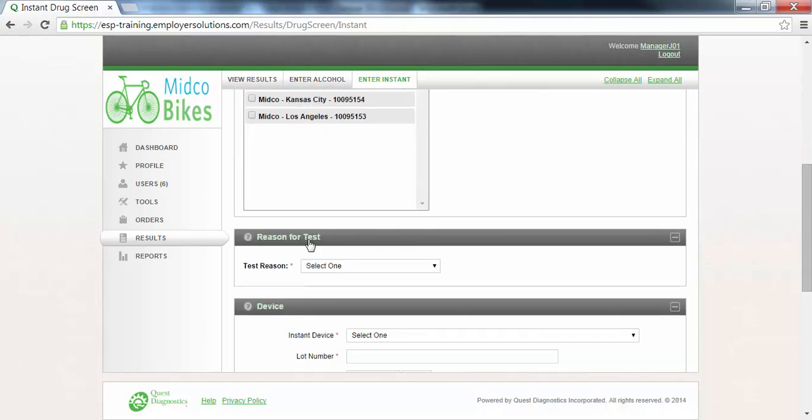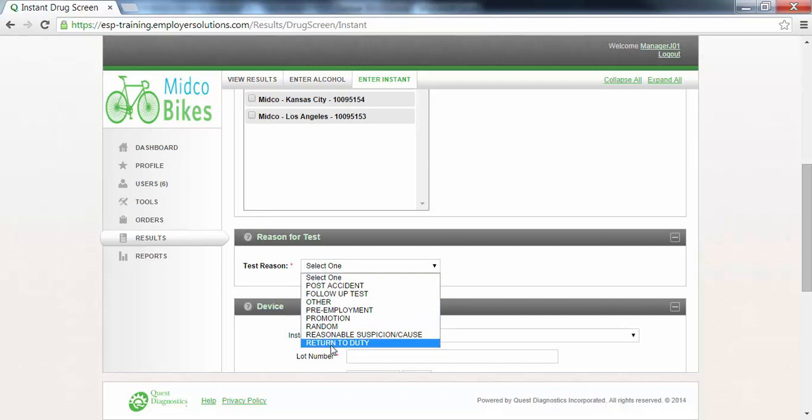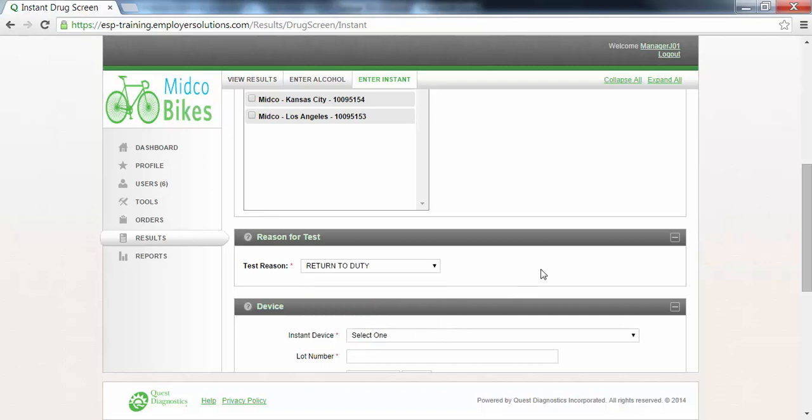The reason for test section is where you will select the test reason for this donor from the drop-down list. In this example we will select return to duty.